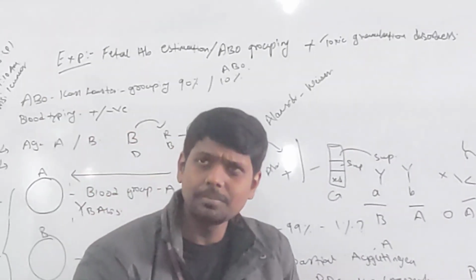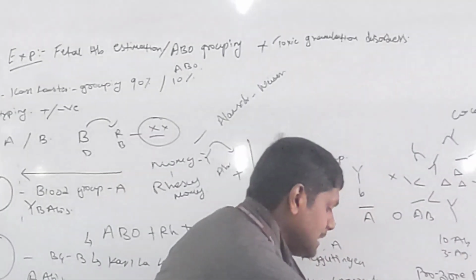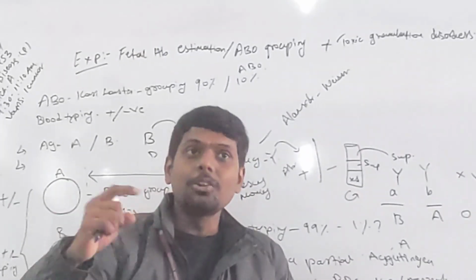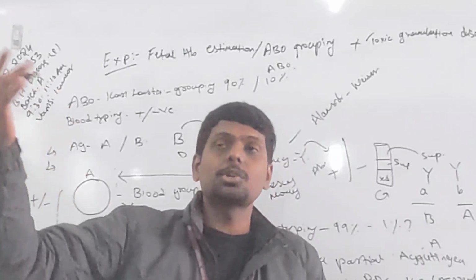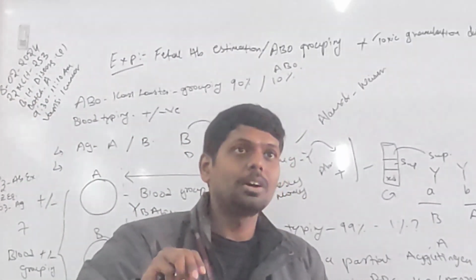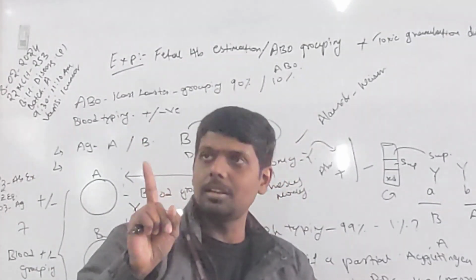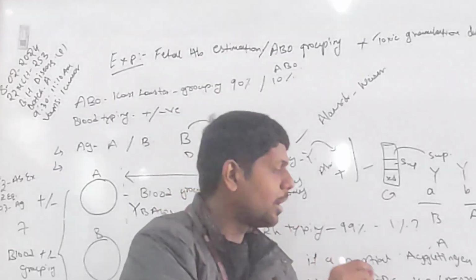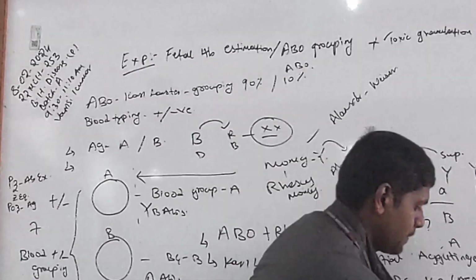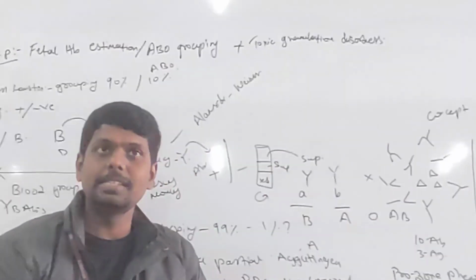Improper temperature. The room temperature affects. Listen, most of the reactions happen at the ideal temperature, room temperature. When the room temperature is too cold or too hot, usually this happens in PHCs, primary healthcare centers. They don't have much infrastructure, so obviously the temperature is one factor leading to false negative results. Any more? Expired reagents. Expired reagents can cause negative results. Any more?